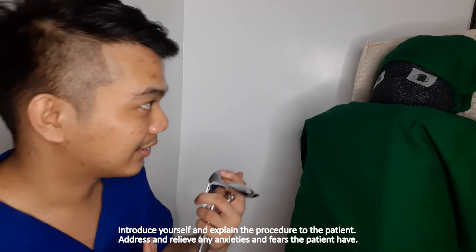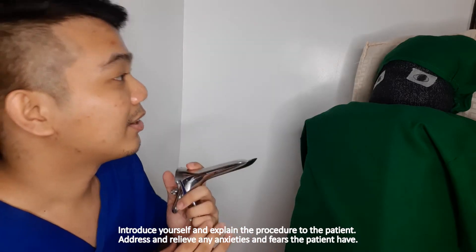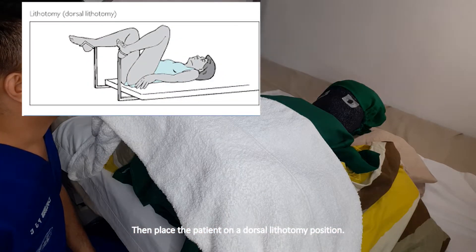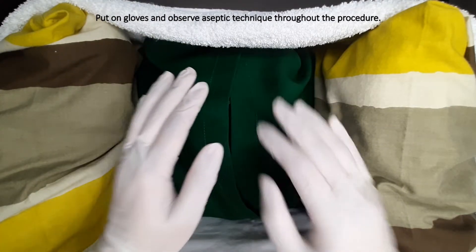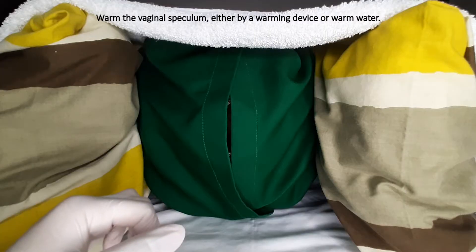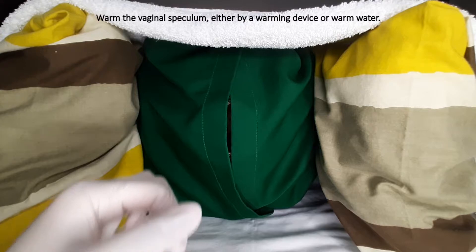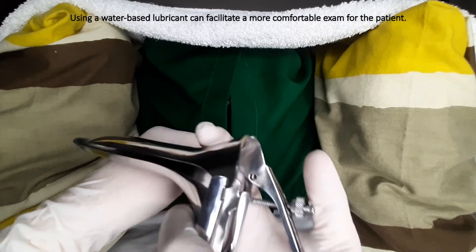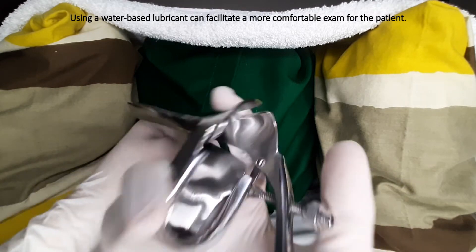Introduce yourself and explain the procedure to the patient. Address and relieve any anxieties and fears the patient may have. Then place the patient in a dorsal lithotomy position. Put on gloves and observe aseptic technique throughout the procedure. Warm the vaginal speculum either by a warming device or warm water. Using a water-based lubricant can facilitate a more comfortable exam for the patient.